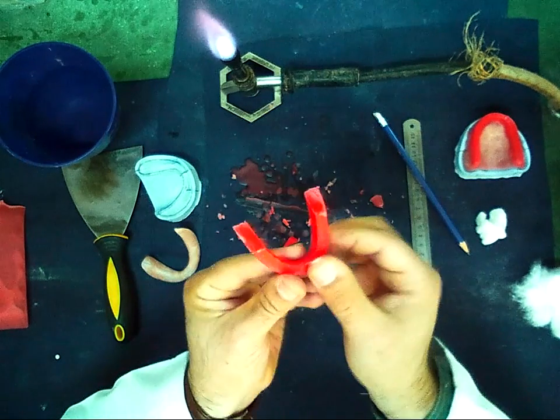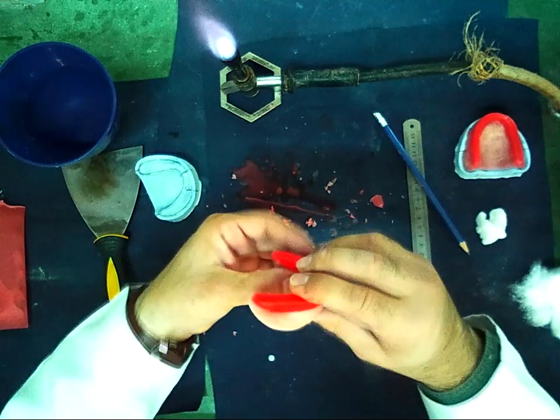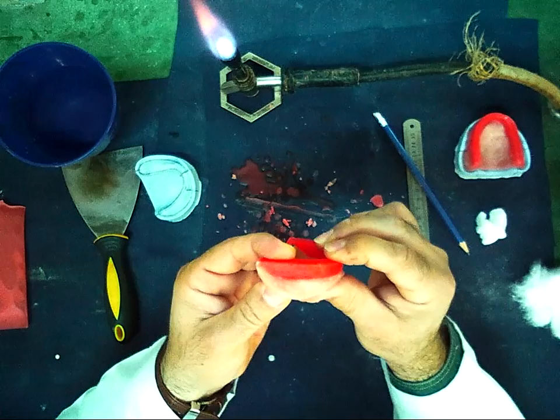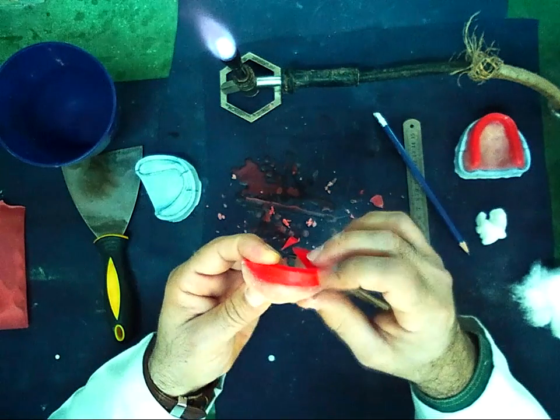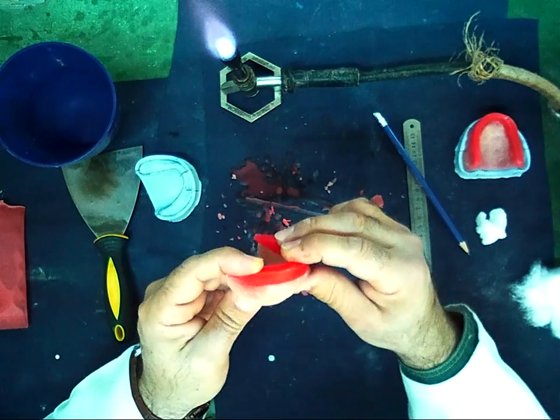Like this. When I put it now, it is easy to make the space disappear, or there will be a little space. I can fill it with the wax.